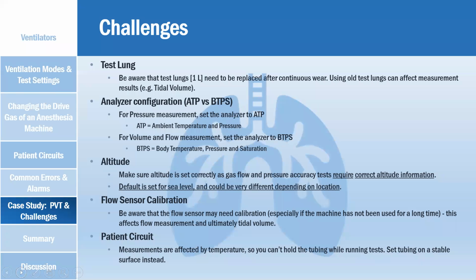You're going to get some affected measurement, because what happens is if the test lung has never been used for a very long time and kept, the rubber seal is going to become harder and sticky, and sometimes you're going to get the pressure reading completely different because the expansion is not good enough. So these are challenges that you're going to see.